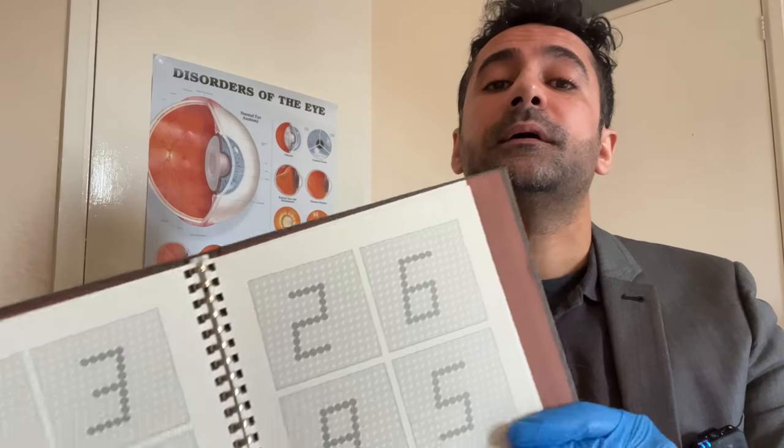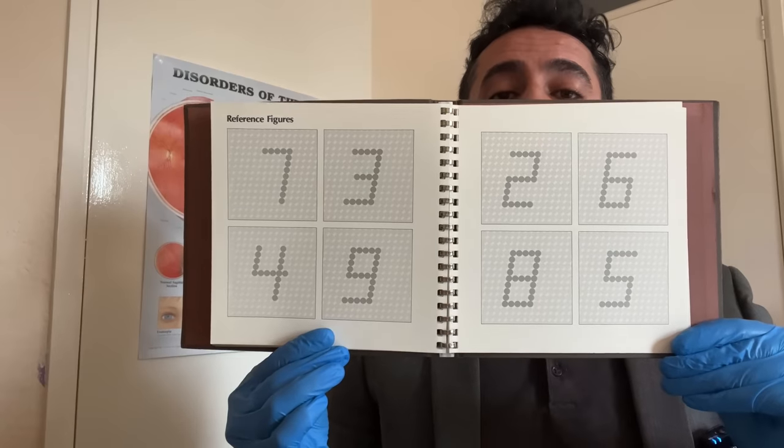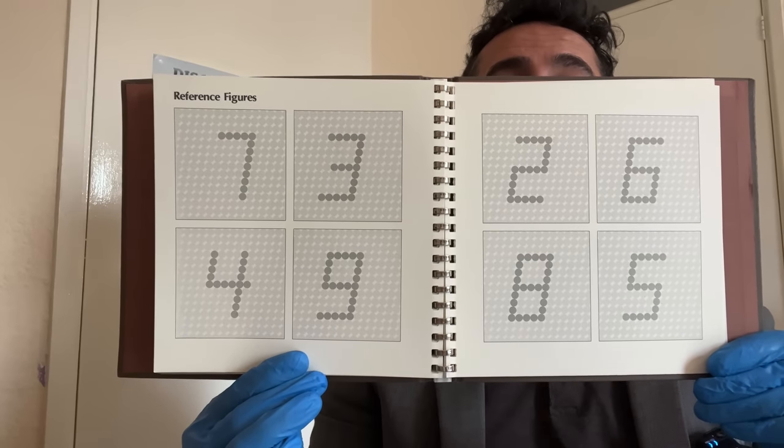Now before I show you any of the plates, I'm going to show you the reference figures that are used for this test, so you can familiarize yourself with what you're going to be seeing. There are the reference figures — spend a few moments getting to know what's going to be used during this test. I'm going to be wearing the gloves so that we don't taint or smudge any of the plates.